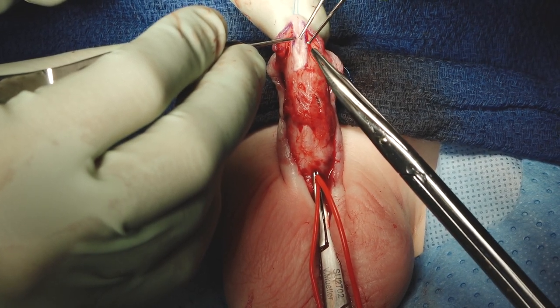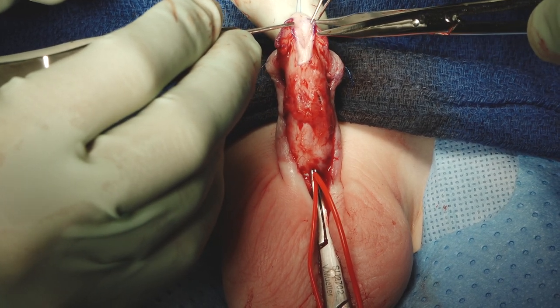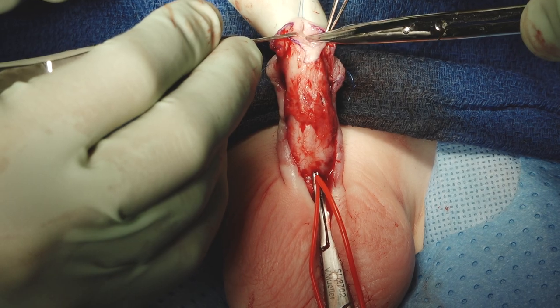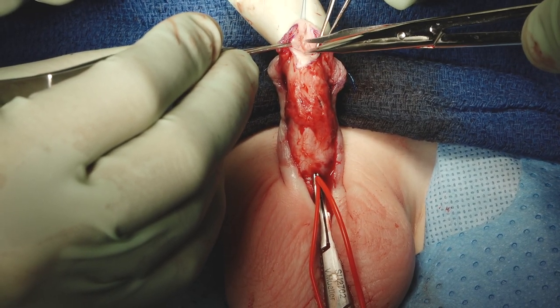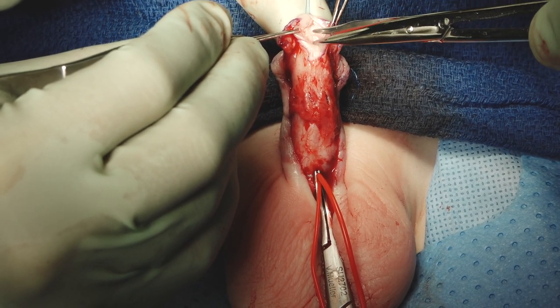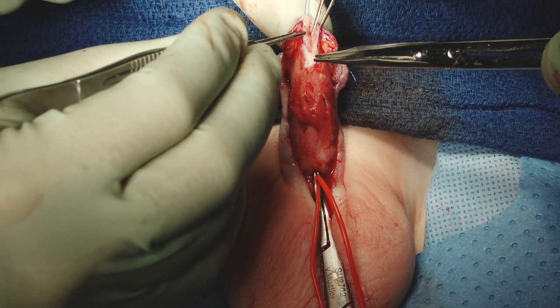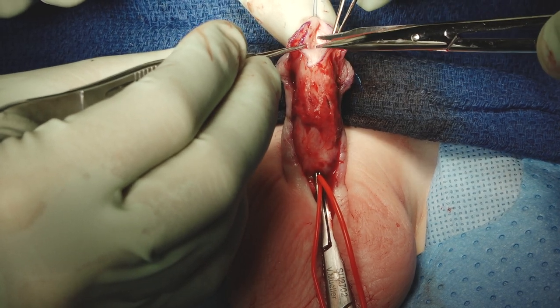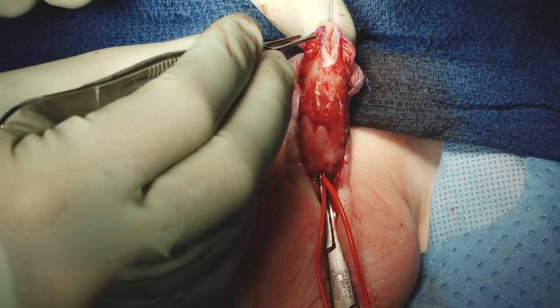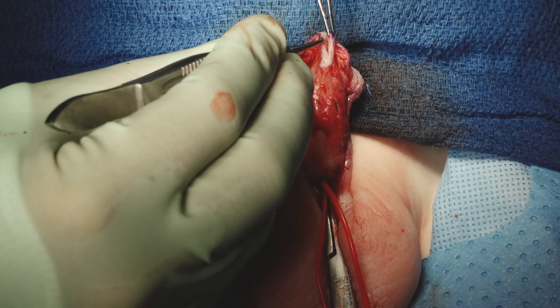Now we're going to incise our urethral plate. I don't normally put my finger back behind it, but because the angle shows better for you, I'll do that right now. We go up and down from within the meatus, staying right in the midline. We keep going until we get to the corpora underneath — you can feel it with the scissors, which is why we use scissors and not a knife. You can see all these tissues releasing underneath. Now we're down — that's corpora right there. You can see how beautifully wide this is and how there's going to be absolutely no tension on that urethroplasty closure at all.